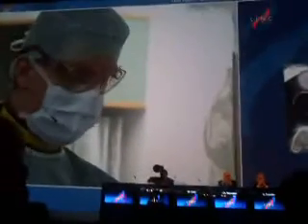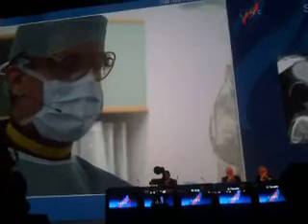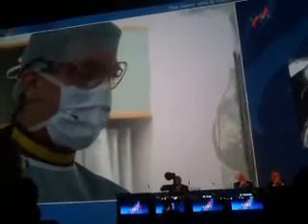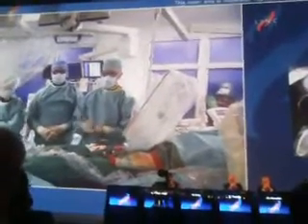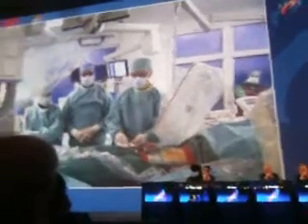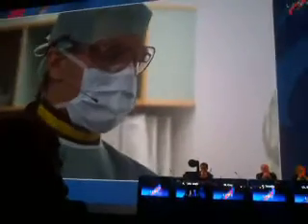So there have been maybe some changes also with the dissection membrane during the last weeks with the new onset of the claudication. The hypertension is fully controlled, so you could maybe say it's a borderline case between uncomplicated and complicated. There is a little bit of ischemia on the right leg now, but also in line with the new data from the INSTEAD trial, we found it worthwhile to show once again the dissection. As you know, the data show that stenting is indeed better for chronic or subacute uncomplicated dissection than standard medical treatment. Okay, so we are ready here to continue now with the angio.